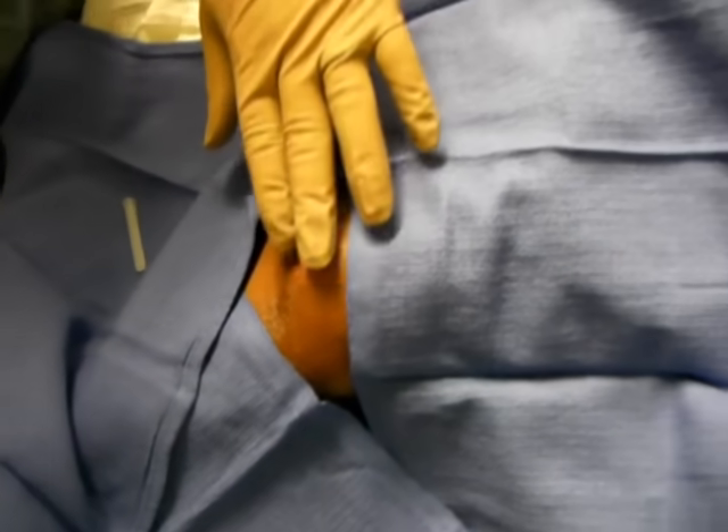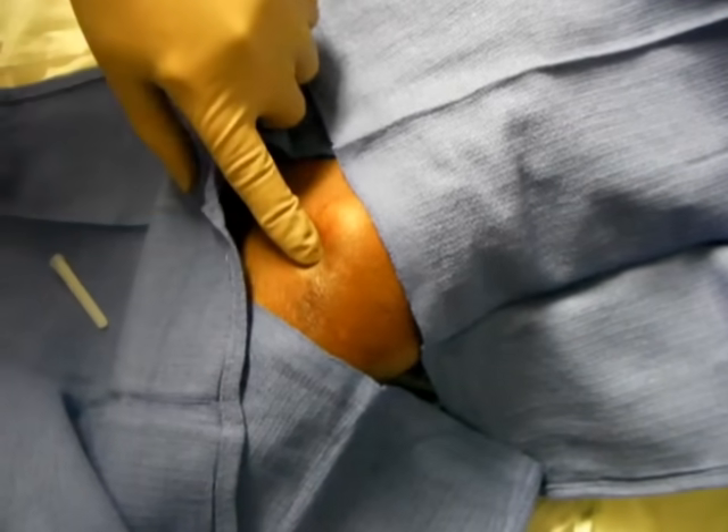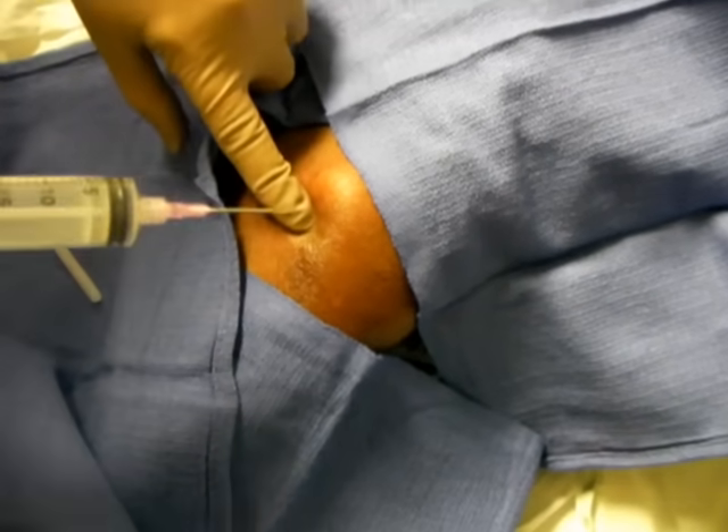As you can see, the knee is already prepped and draped along the medial aspect. The medial aspect is only visualized here, and she's already been anesthetized with 1% lidocaine in the area. What I'm doing now is palpating along medial to the patella, which I can feel here, and I can feel a nice soft area in there between where the tibia and the femur come together in the joint.